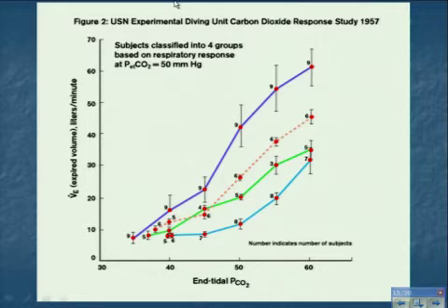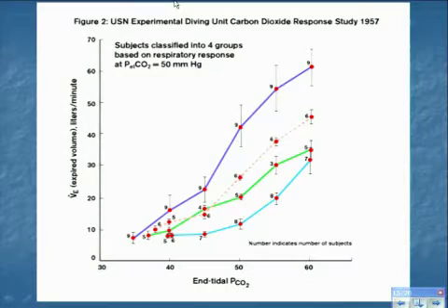Now, we used to prove this to ourselves. We would strap on. Please don't do this because then they'll think you're doing nitrous oxide on the floor or in the operating room. Make sure you're doing it with a bunch of people. So don't do this by yourself, this experiment, okay? But I'm telling you about it, but please don't do that because then you're getting all sorts of trouble. You put the oxygen mask on you. You strap it on. You go to 100% oxygen. Put a pulse oximeter on your finger, okay? And then tell yourself, I'm going to hold my breath.